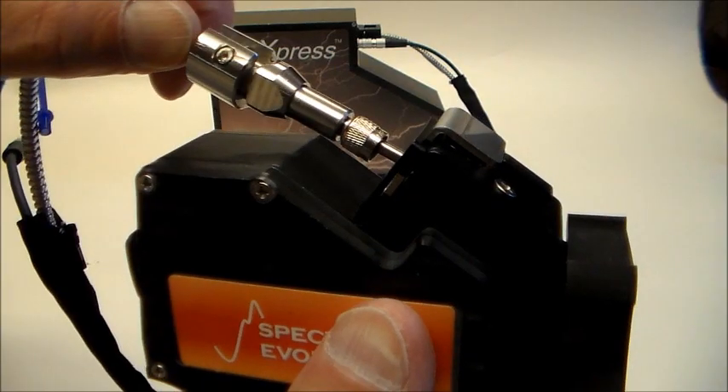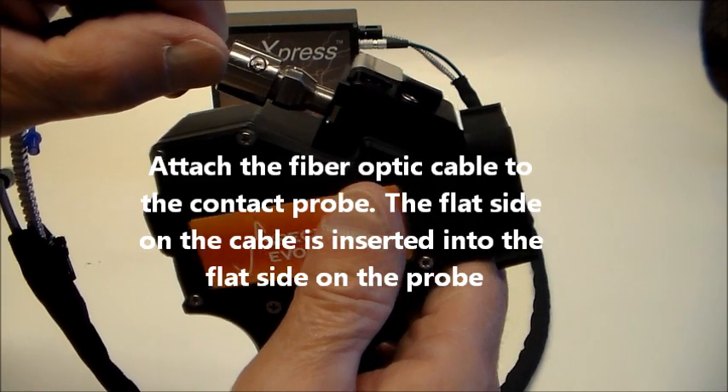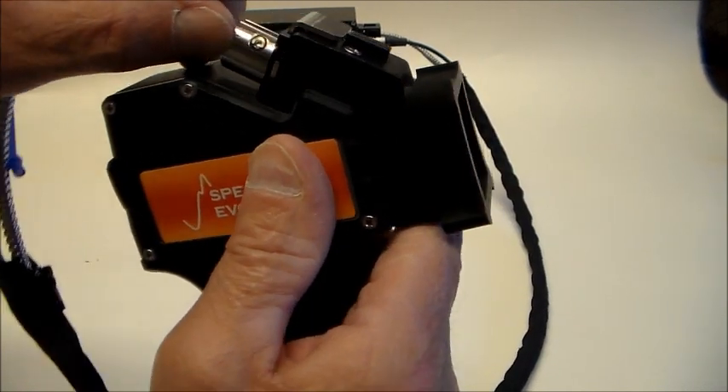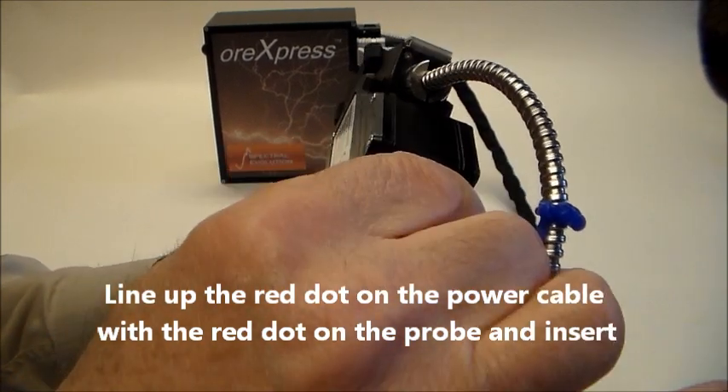The fiber-optic cable attaches by lining up the flat spot on the cable connector with the flat spot on the probe. The fiber-optic cable remains connected until you press the quick release. Line up the red dots on the instrument and the power cable connection and insert.